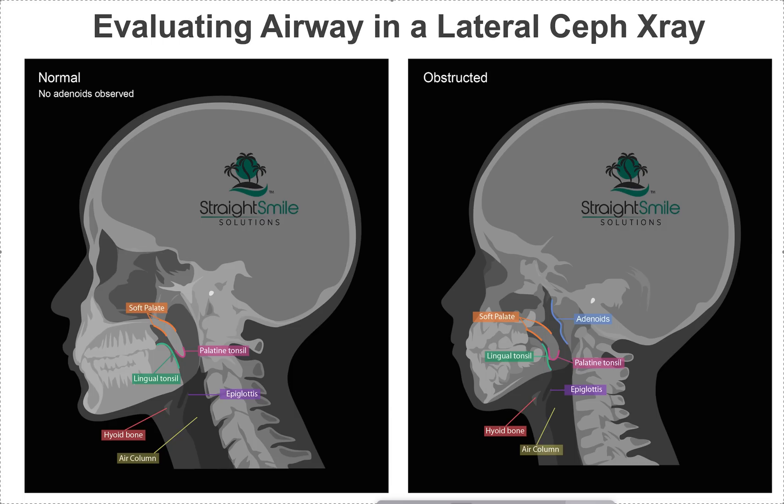On the left, we have an adult with no obvious adenoids present. You can see where the adenoids are on the right side. Usually you'll see this kind of round, bulbous lump right here. Adenoids you cannot see clinically, but you can see them in an x-ray.